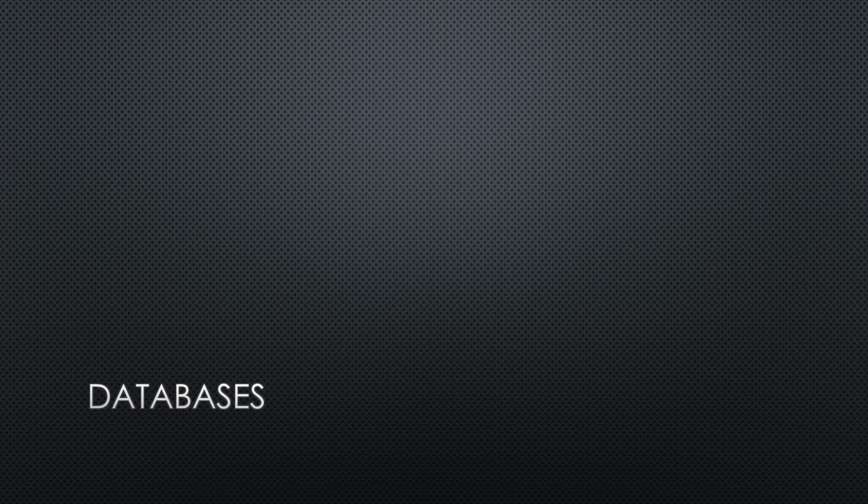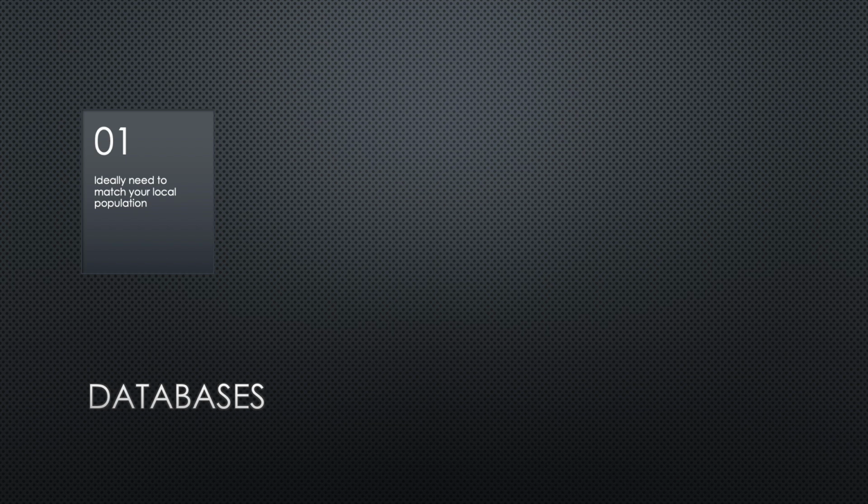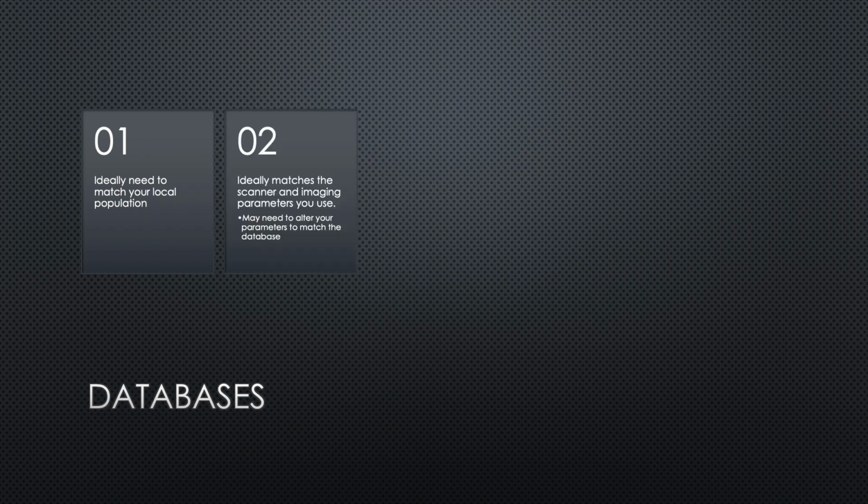I want to talk about databases that we would use to make comparisons. So these databases of healthy, normal individuals. There are some challenges associated with them. One is that ideally the database that you have should match your local population.